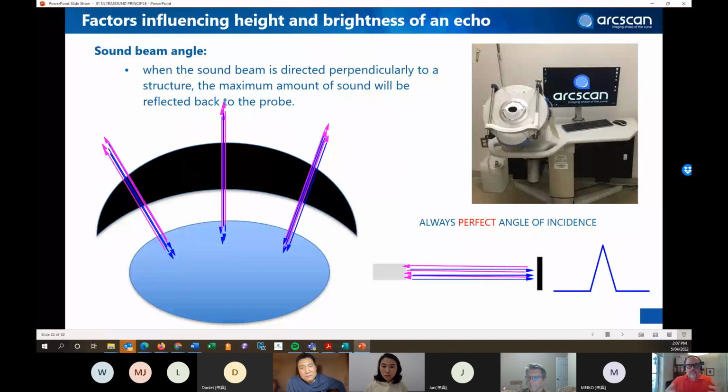But the eye in general is not flat. The eye is curved. The crystalline lens is curved, the iris is a little bit curved, so there is a little bit of curve everywhere. Now, when you do this position, the linear one is the way to go, and this is the area that I'm evaluating here.